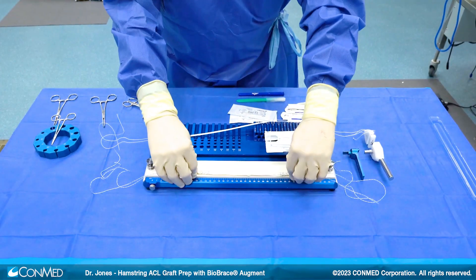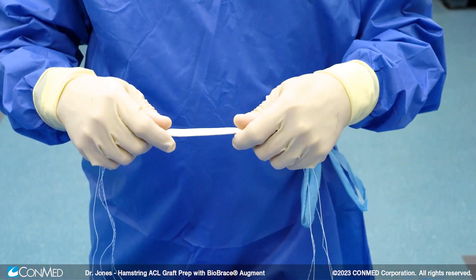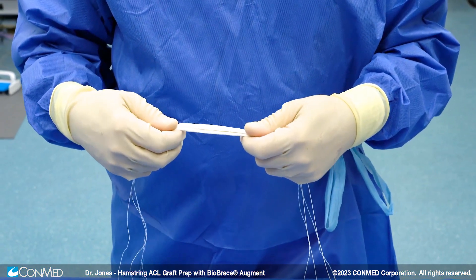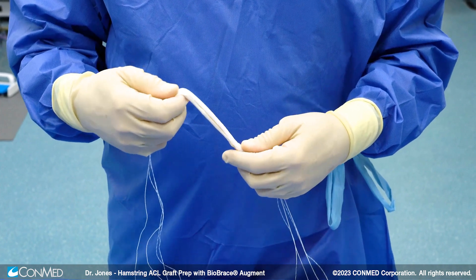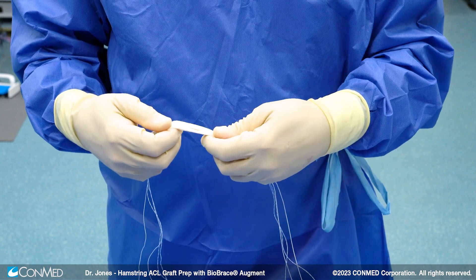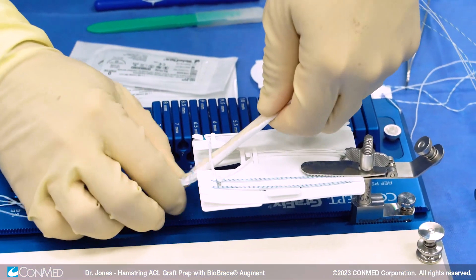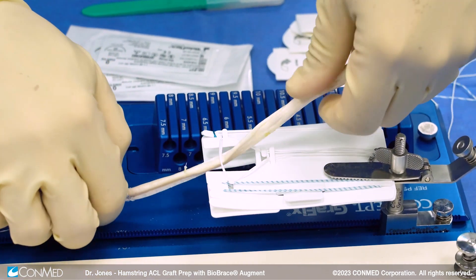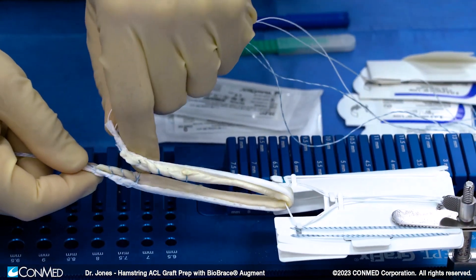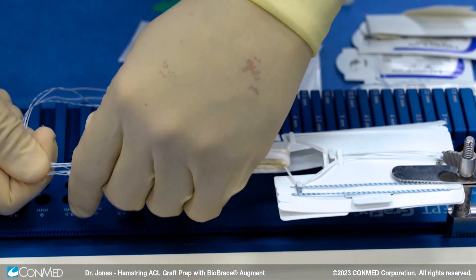Now we're going to take our biobrace and add it to our allograft. One question is whether you want the biobrace exposed to the bony contour of the femoral and tibial tunnels — and I suggest yes, because it has collagen type 1 that will allow for incorporation of the biobrace and tissue together. So now we're going to pass it through our loop. As we pull through, we want to continue keeping the biobrace exposed to the outside part of that graft, so once it's pulled into the tunnel the biobrace will be exposed to the healing potential of the patient.